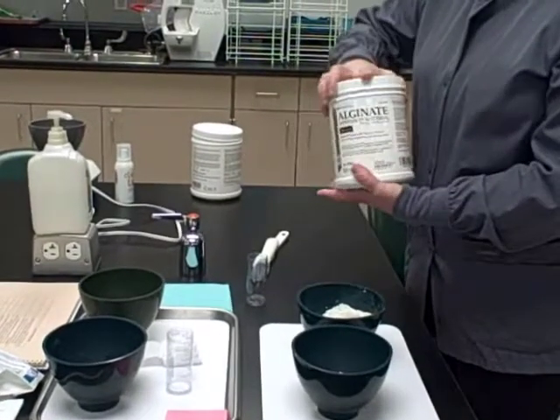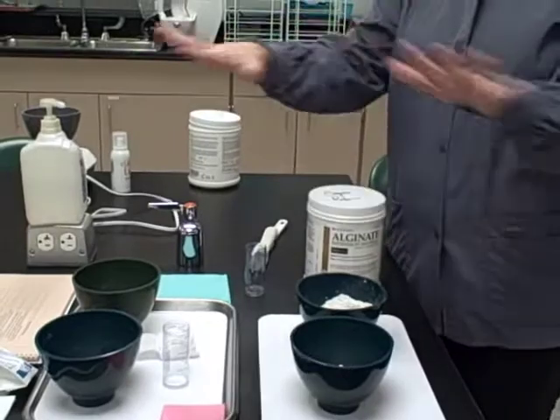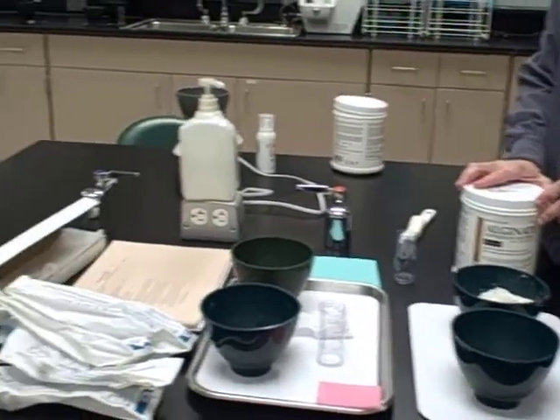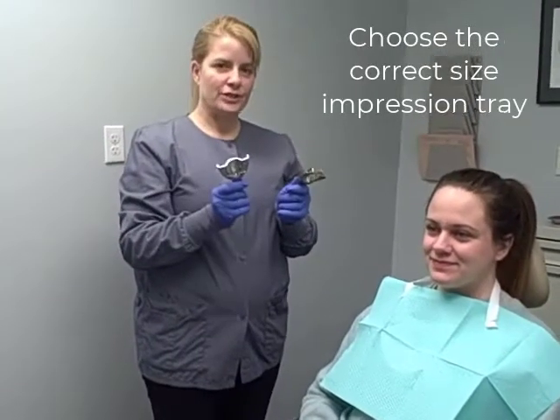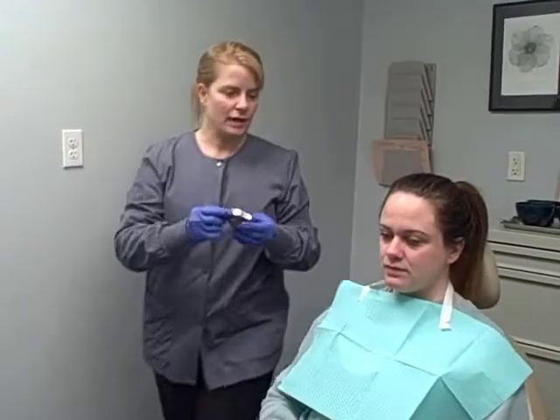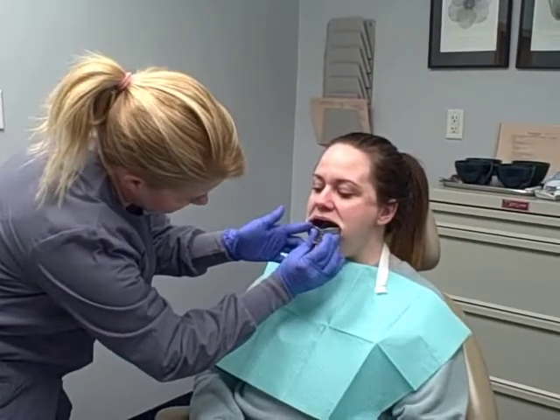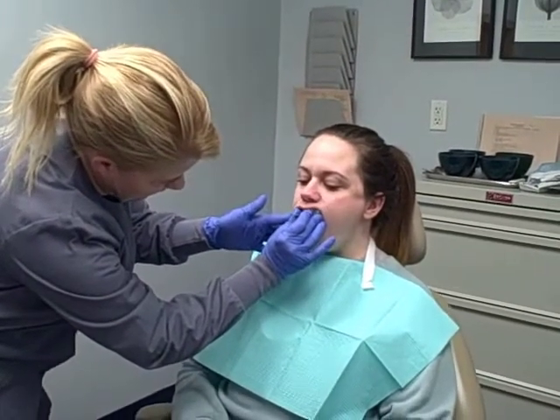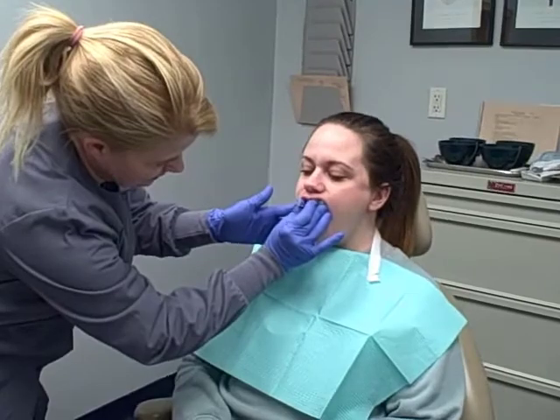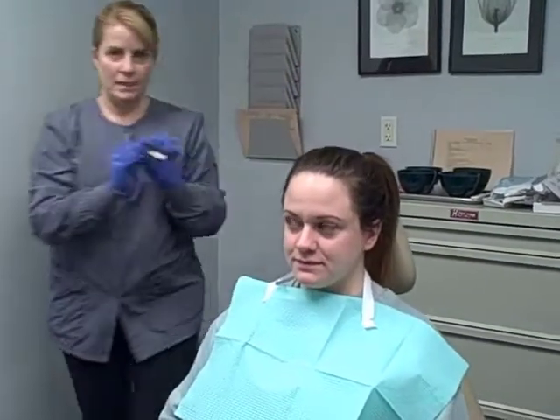Now we're going to move into the clinic and take some impressions — this is the armamentarium that we need to get started. We are going to first demonstrate trying in the tray. Try in the maxillary tray first. Make sure that it's not hanging up on the teeth in the back. That fits well.